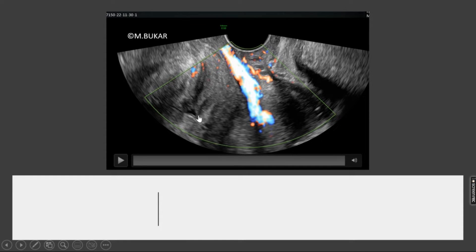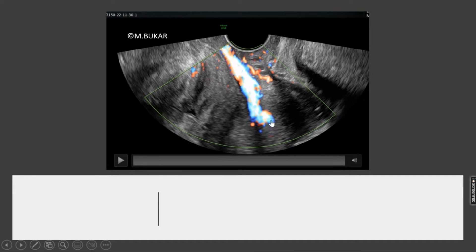This is the bladder. If a line is drawn from the bladder across here, this line will cross the internal os. Therefore, the origin of the polyp is above the internal os and is therefore in the lower corpus.